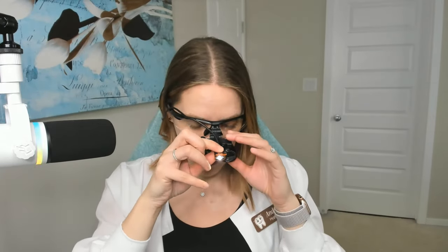Now it does come with this orange cover. That is if you're working in a dental office and let's say you're doing a filling or something that cures quickly, you don't want the light to be directly on it because it's going to cure it too fast. So you are going to move the orange cover. I'm never going to use the orange cover, so I'm probably just going to take it off. But for the sake of this video, for now, I'm just tucking it behind.